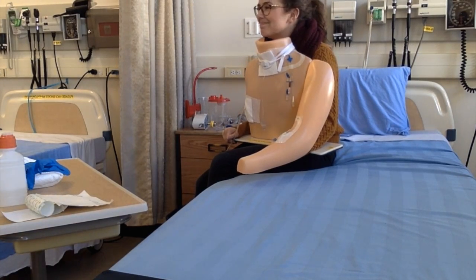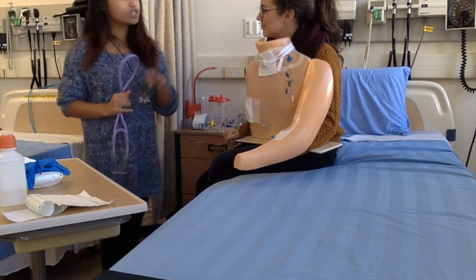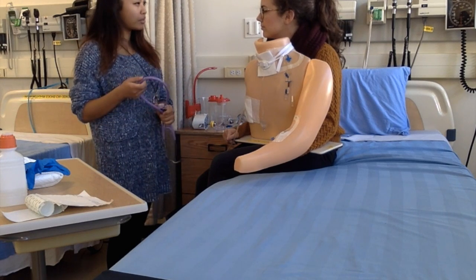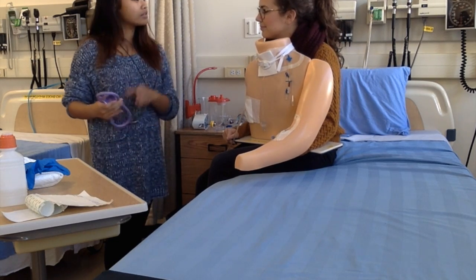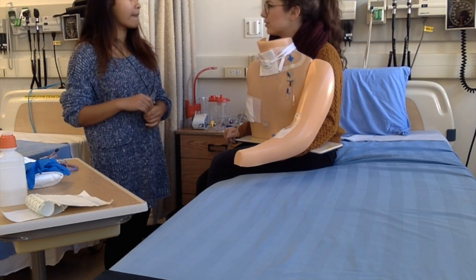Hello? Hi, Melissa. I'm Marianne. I'm just going to be your student nurse for the day. So your doctor had ordered me to do a dressing change for your chest tube. Would that be okay with you in a little bit? Mm-hmm. Sounds good. Before I start, I'm just going to do a quick assessment, just make sure everything's running properly. Okay. How's your breathing going? It's better than yesterday, but I'm in quite a bit of pain.